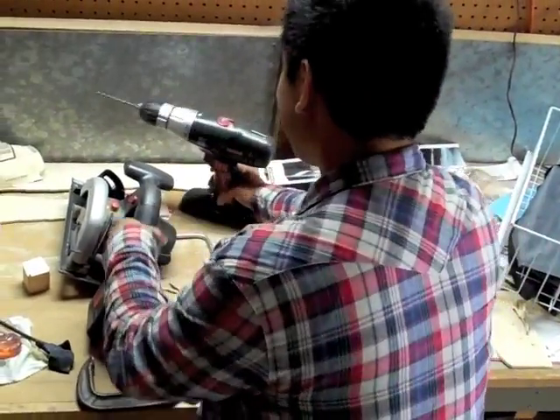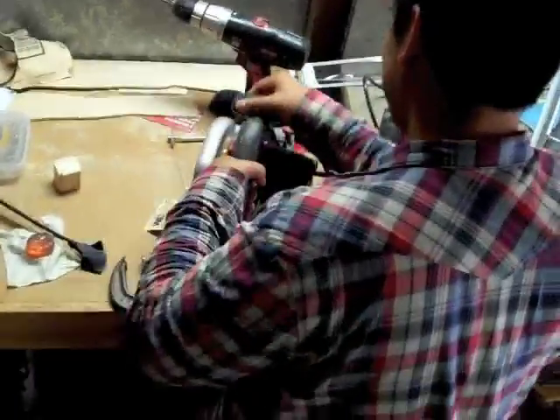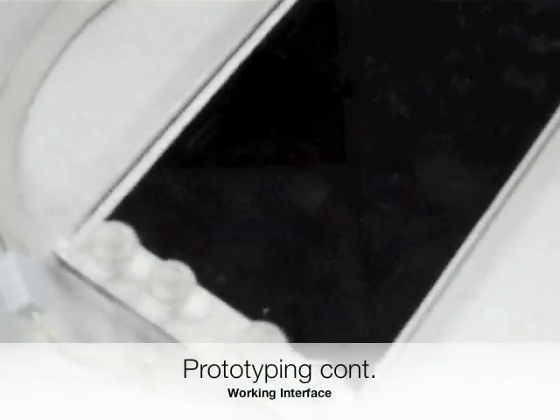began with purchasing a sheet of raw acrylic. The half-inch thick acrylic was then cut, sandpapered, filleted, and polished before external buttons were fastened. This physical prototype helps us understand the dimensionality of the device, and alongside this prototype, a working interface was created apart from it to help us get a feel for how the touchscreen would look and function.